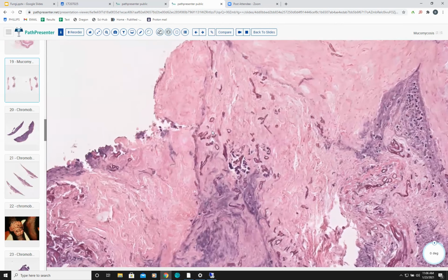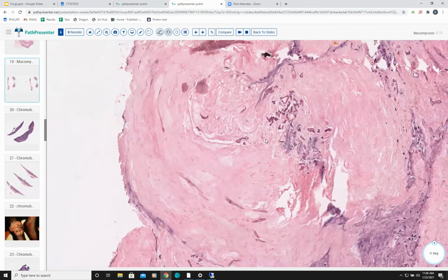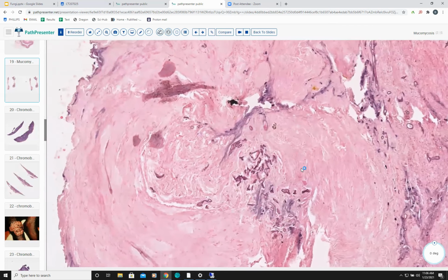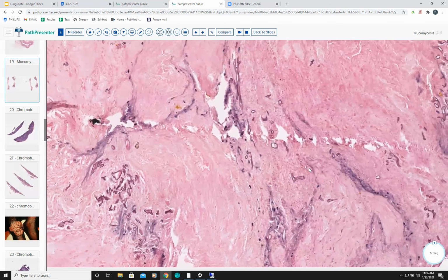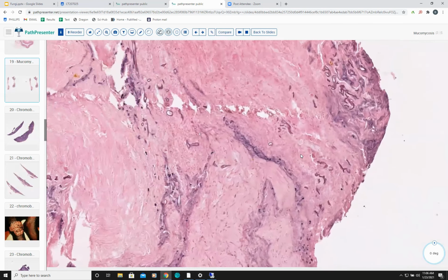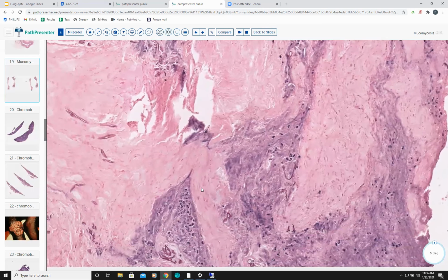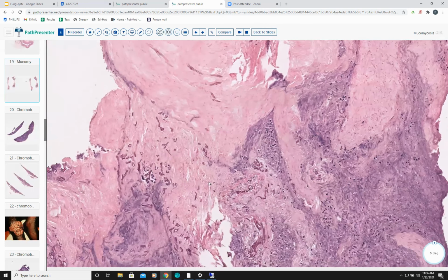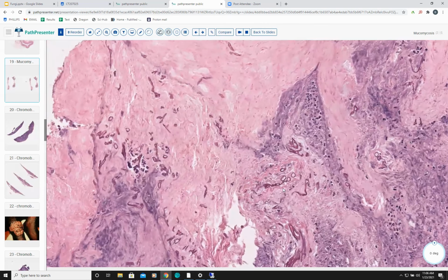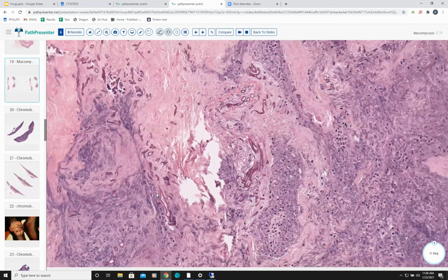And this is fairly characteristic. They love this on boards, these ribbon-like organisms, and not 45-degree angles and not septate, because both the clinical and the histology differential is aspergillus versus mucormycosis. So a very nice case, with these ribbon-like hyphal forms, mucormycosis.